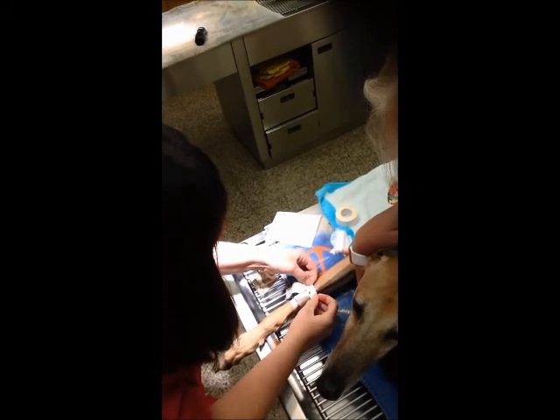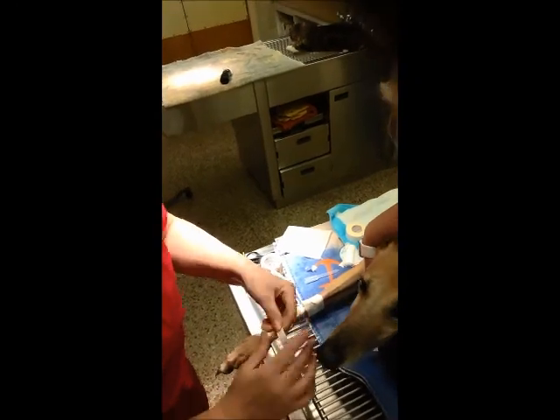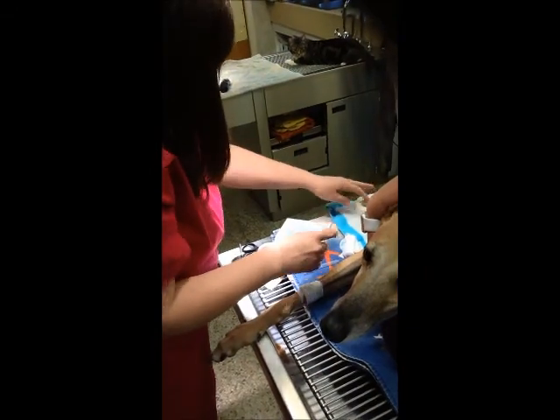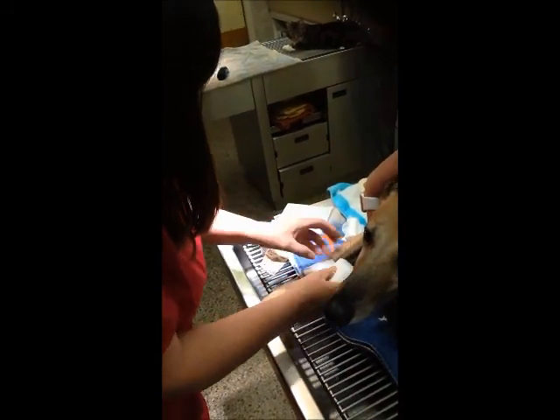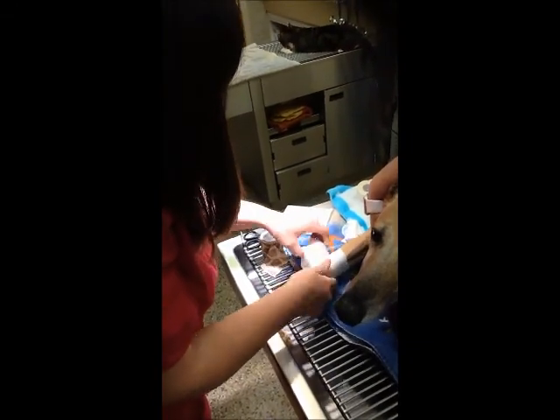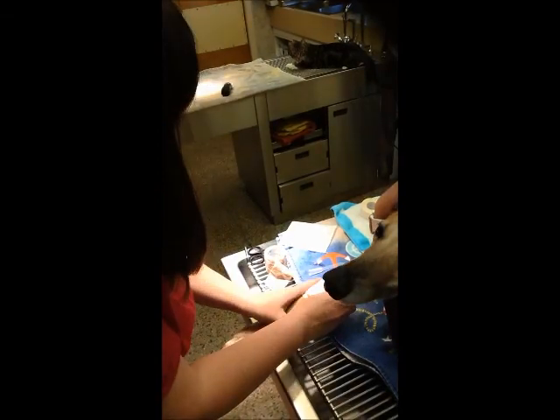Neosporin and the bandage on the catheter site. And then I take our stirrup and put it on here. And then I'm going to take my bandage material. And then clean.